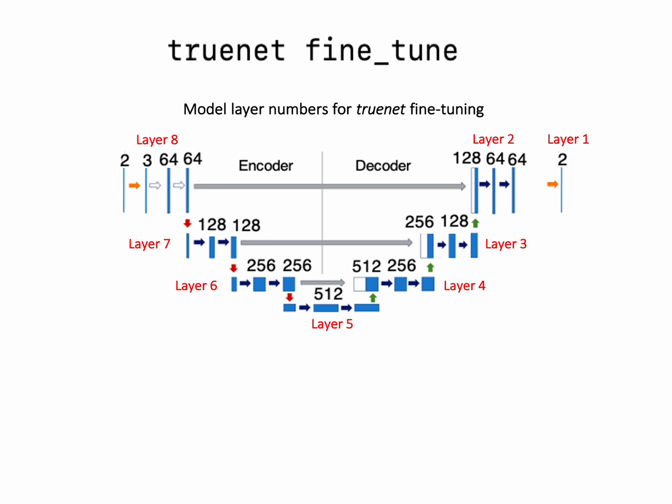If you remember the U-Net building block that I explained earlier, we actually have the layer wise architecture of U-Net. What we do in fine tuning is that we tweak the model a little bit to adjust to the lesion characteristics of the new data set, which means we don't want to train the whole model.